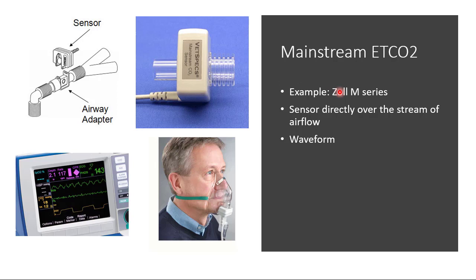The old Zoll M series, and I think the E series, used to use these. Now the downside, why they're not used as much anymore in the EMS setting, is they take about 30 seconds to, quote unquote, warm up and calibrate. And also, you look at this, it's a bit of weight on the end of an endotracheal tube, and you really don't want that in the pre-hospital setting. The more weight you have on an endotracheal tube, this can pull it out, cause dislodgement, cause difficulties in management, or push it down. You don't want that.